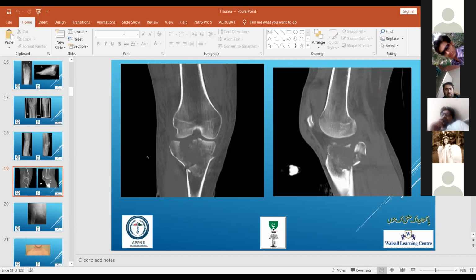What we have is pins in. You can put plates in there and do an Ilizarov on it. You can bone graft it and put an Ilizarov on it, augmented with an Ilizarov. I could be totally wrong, but personally I don't do Ilizarovs. I do what is called a hybrid fixator. I would put a ring here and then put pins in the tibia. That's what I do.